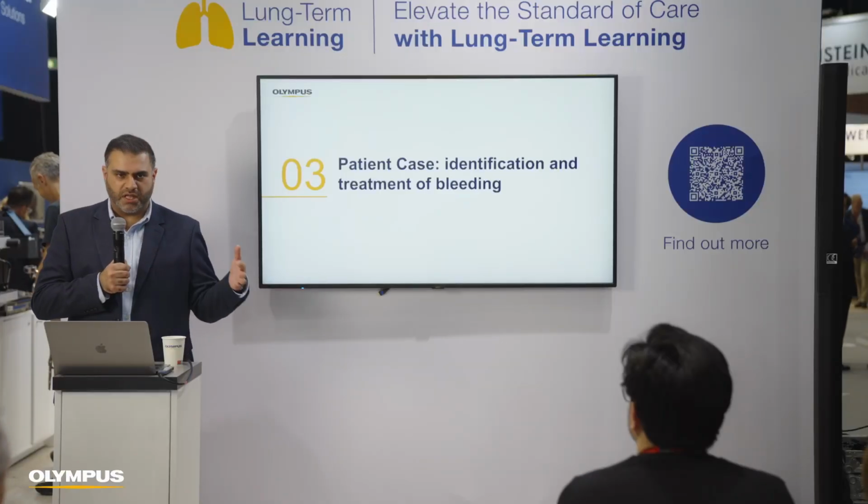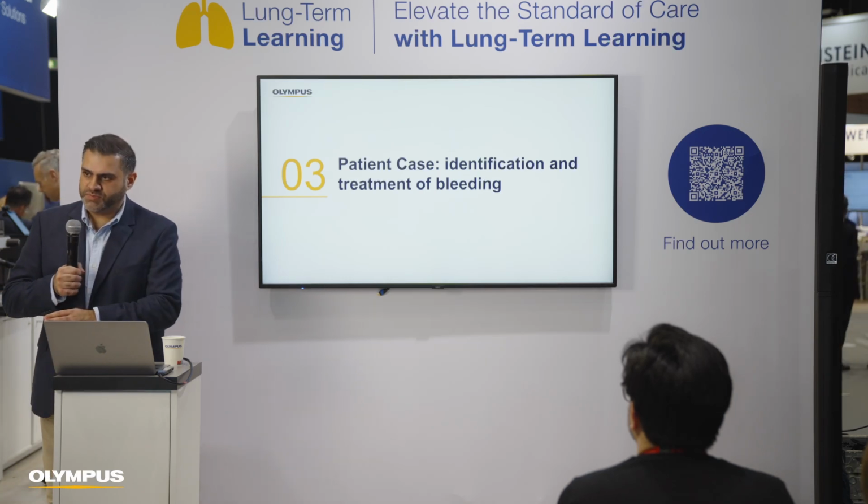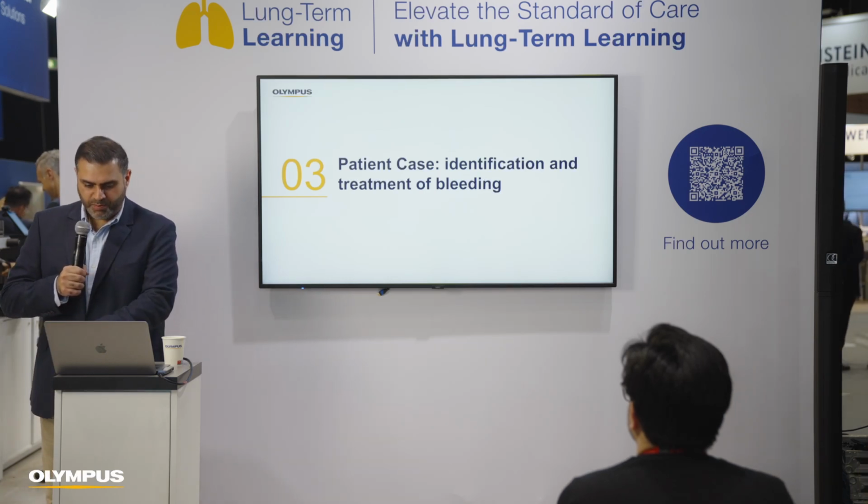So I'm going to go through a few patient cases. We're going to start with something straightforward and then work our way up to something more blood pressure raising.